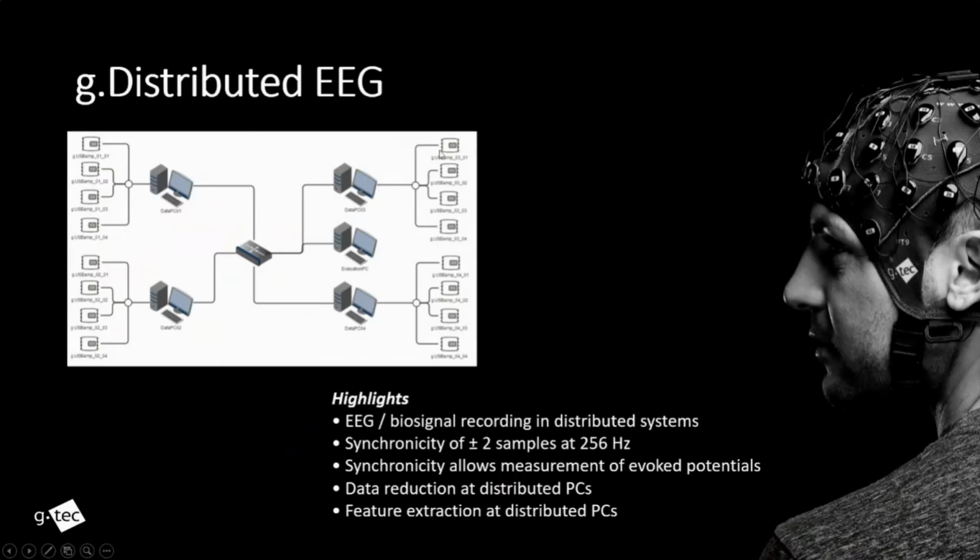These all are little components on the USBamp through one PC, and the data will be sent to the central PC, which we call the evaluation PC, eval PC. Different data PCs can connect with different numbers of channels. The purpose here is for the eval PC to be the master PC.